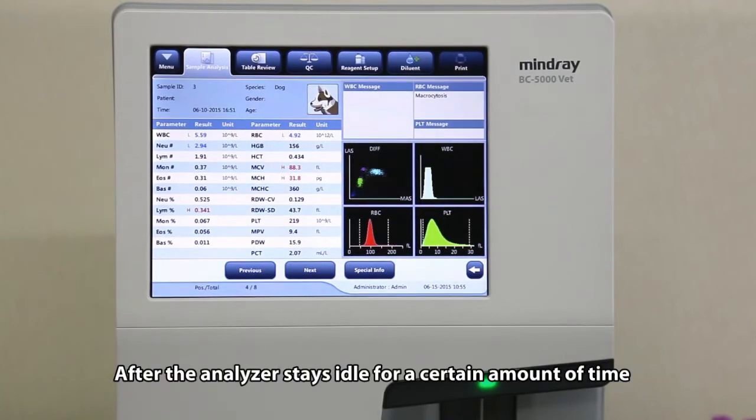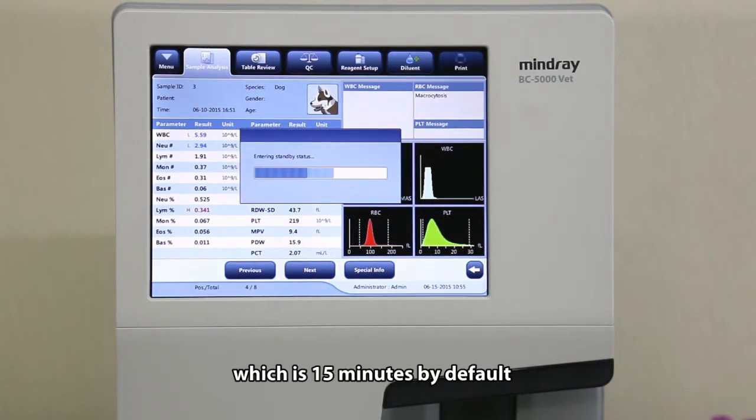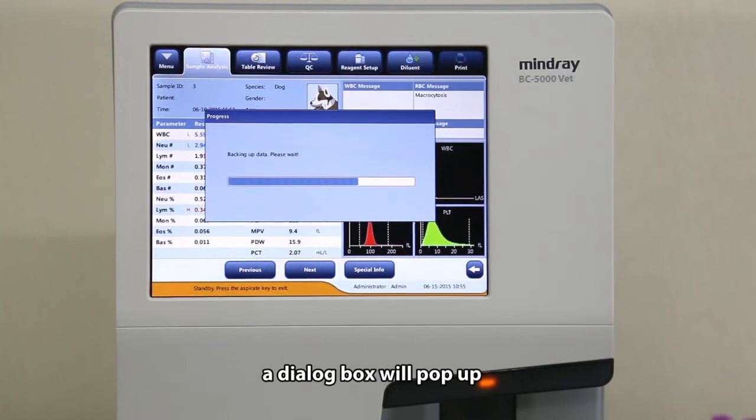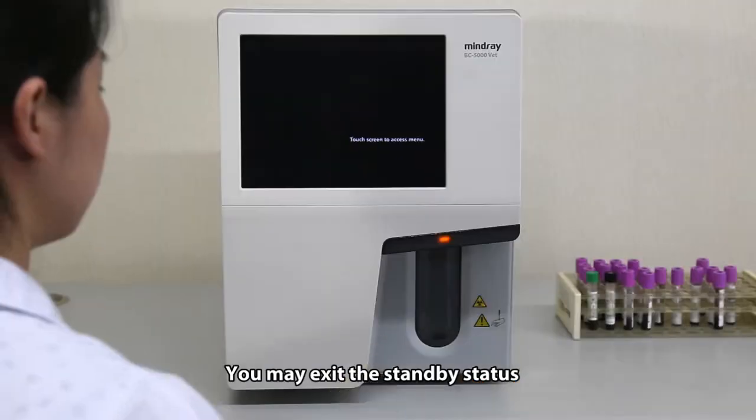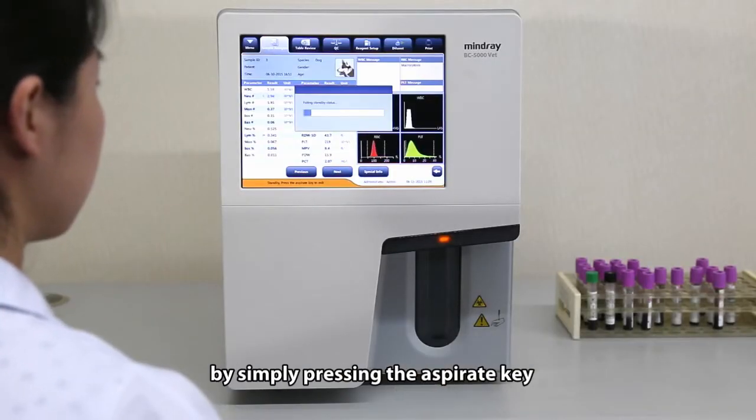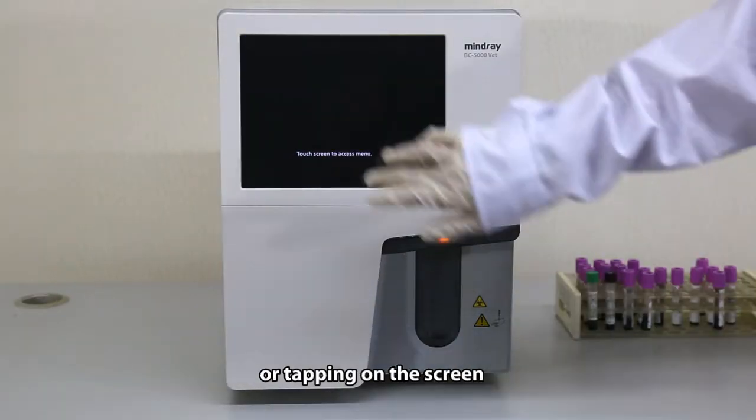After the analyzer stays idle for a certain amount of time, which is 15 minutes by default, a dialog box will pop up prompting entering standby status. You may exit the standby status by simply pressing the aspirate key or tapping on the screen.